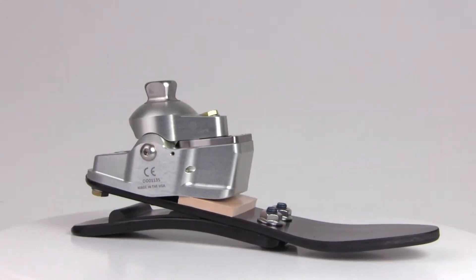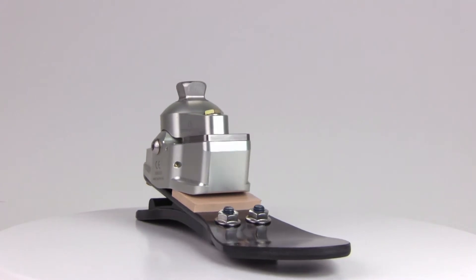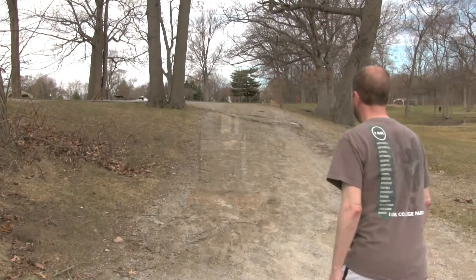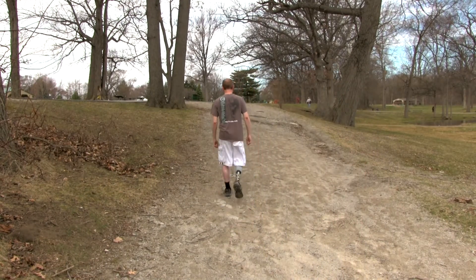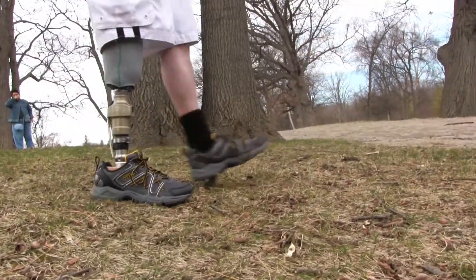The Odyssey K2 foot from College Park provides remarkable patient benefits with a patented curved hydraulic cylinder and teleweave composite foot base and customizable dual stride control. Hydraulic feet can provide K2 patients with an incredible range of controlled motion, as well as assist in force absorption, enhance knee stability, and promote good posture.